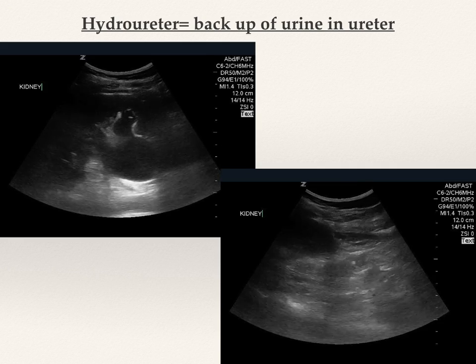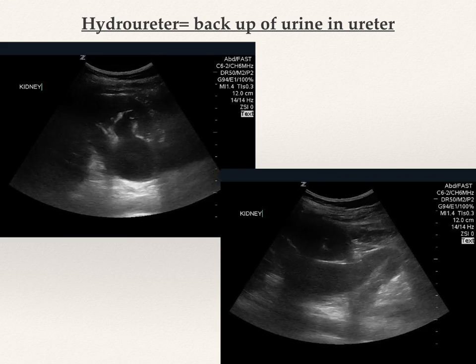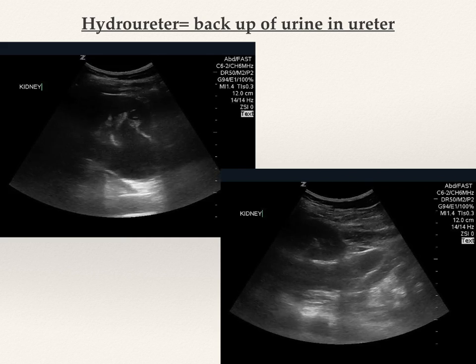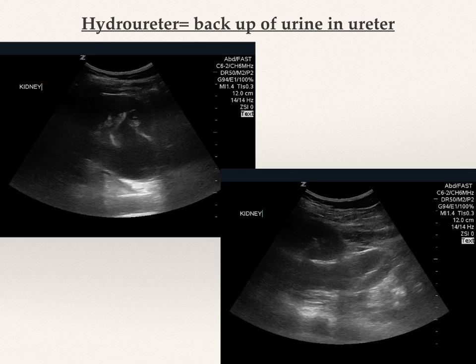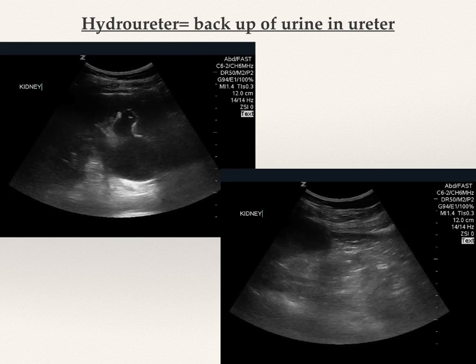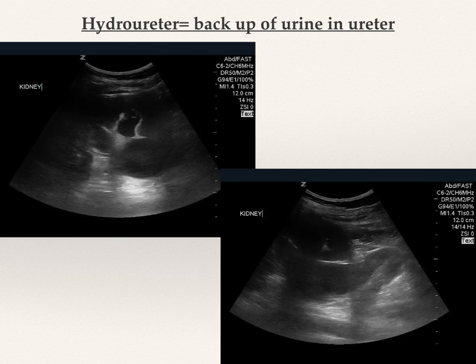This was actually in a lady who was postpartum 3 weeks, and she's like, I was told I had kidney stones before. My left flank still really hurts. And I was like, you look like a peach. I don't need to do anything. And then you scan and you find this. So that's what we did. Got her a formal imaging and got her in touch with urology to help remove a stone.